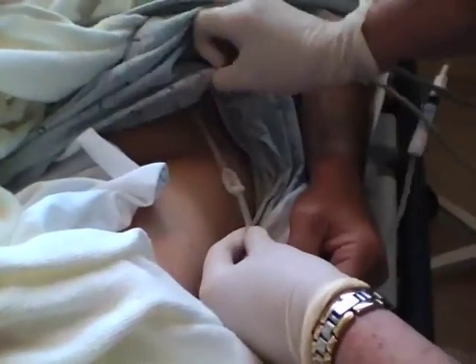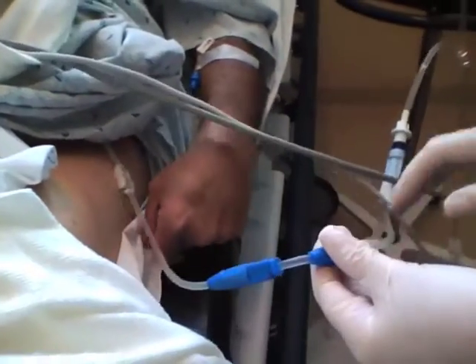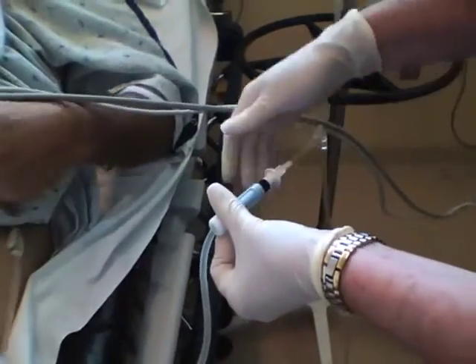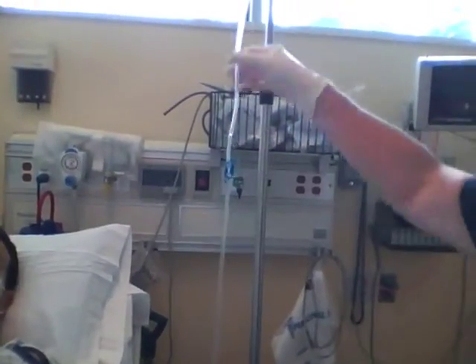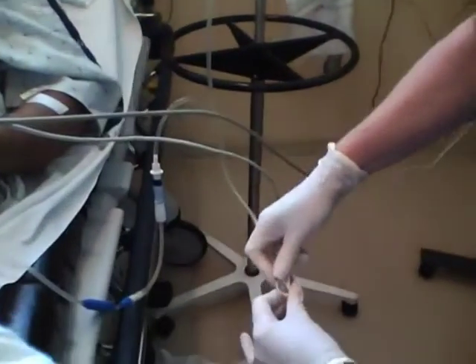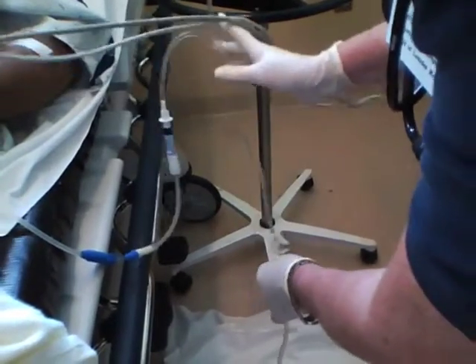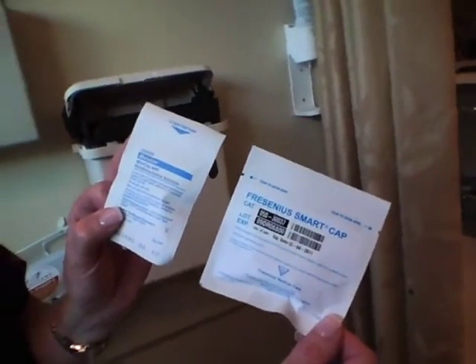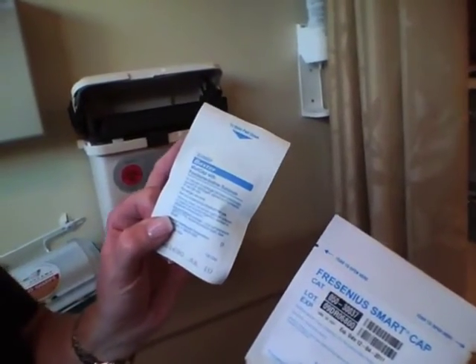You're going to unlock the clamp and go into the Tenckhoff catheter. You're going to unlock this clamp. Make sure that your infusion clamp is clamped, and then you're going to unlock your drain clamp, and we're going to hope to get some drainage. When the dialysis treatment is finished, you're going to replace a cap on top of the tubing. If they're going home, you're going to replace it with a Fresenius cap; if they're staying in the hospital, a Baxter cap.